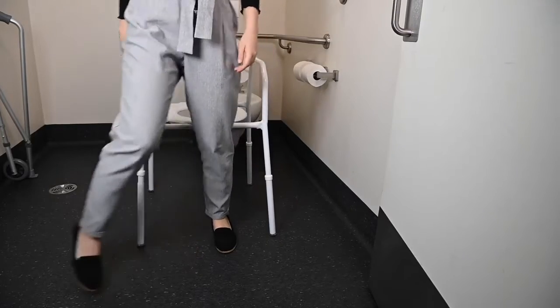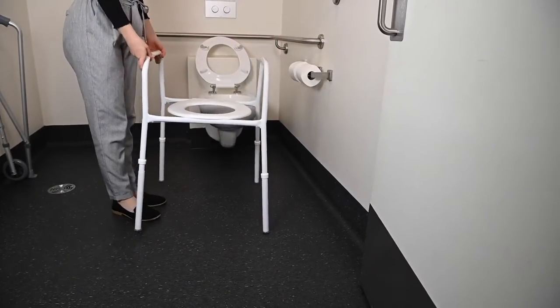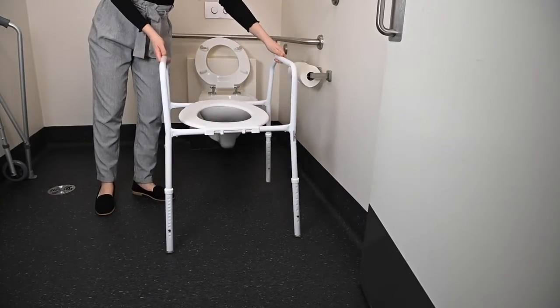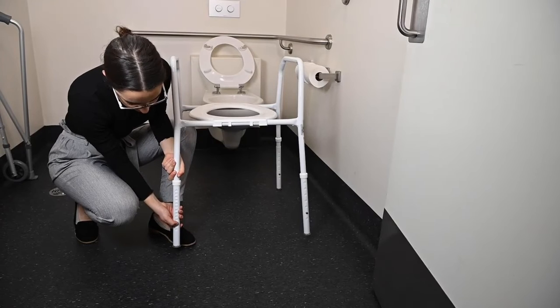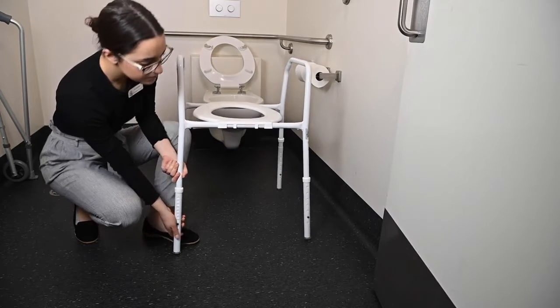Based on your injuries, your occupational therapist will inform you if you require assistance to set up your over toilet frame. To adjust the height, there is a silver locking button and sequence of holes on each leg of the chair. Press in the silver locking button and align it with the hole at the height you wish. All four legs need to be level.